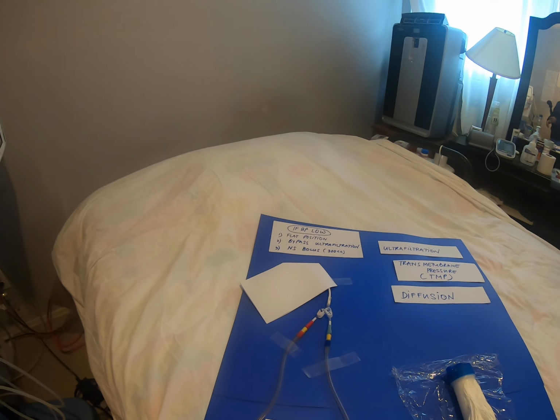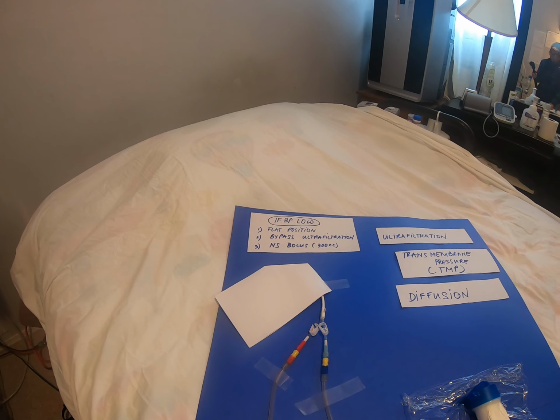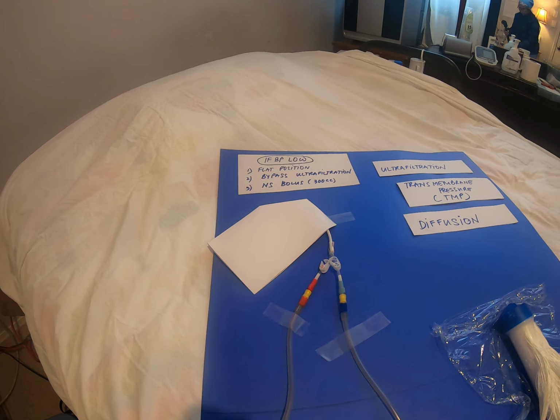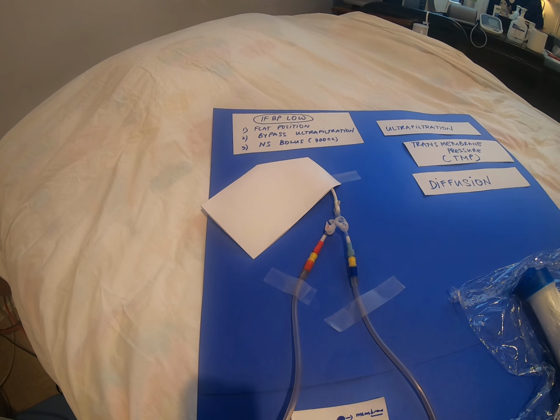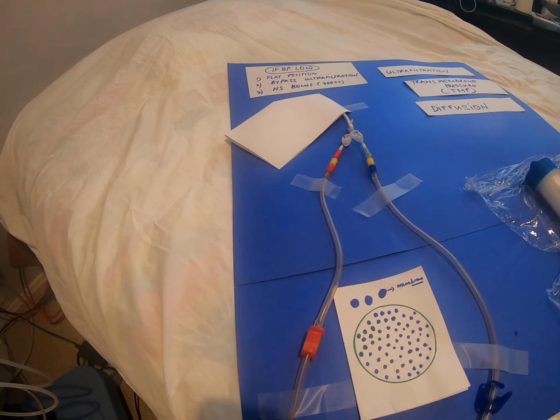If you see that the patient is okay and our maneuvers are effective after the bolus, and you think he can manage, all we have to do is clamp the normal saline tube once the 300 cc is over. Then we have to resume dialysis, so you open your arterial line clamp, and then you start your dialysis.